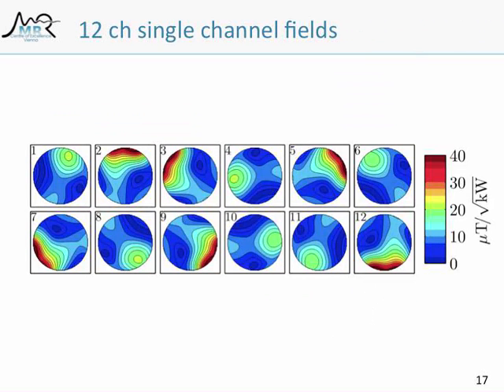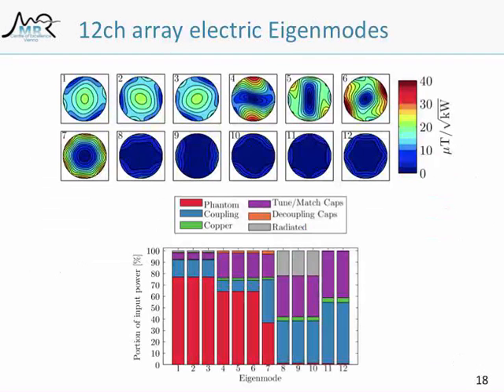So you can simulate the coil, and you can see that's just an axial slice in the XY plane. You can see how the B1 field looks from all the channels. Okay, that's nice that you can get out of every solver, but it gets much more interesting when you now have a look at those modes, because what you now have is basically the equivalent of the fundamental birdcage modes for this coil.